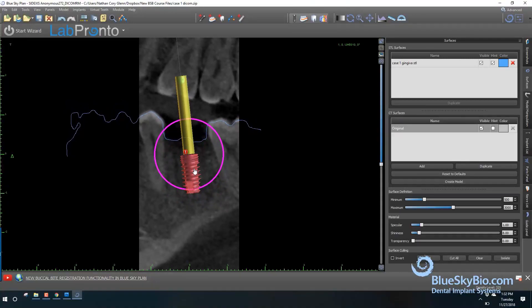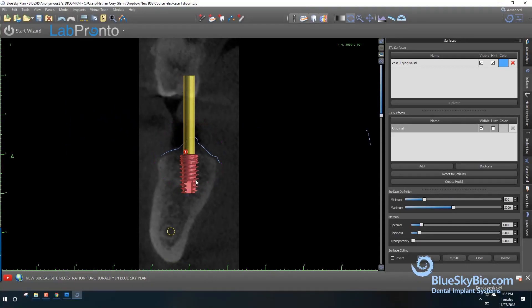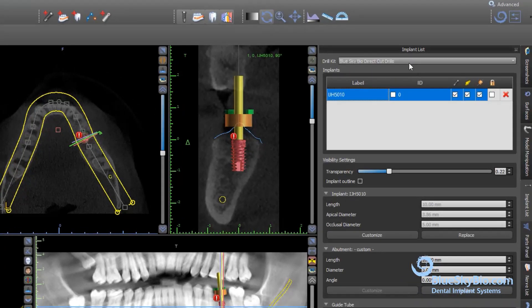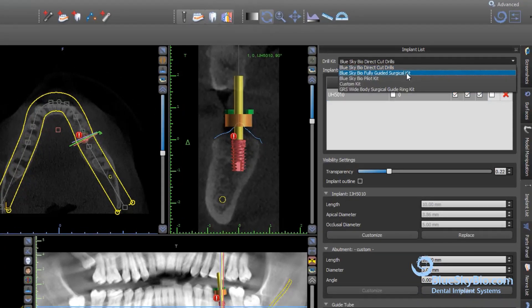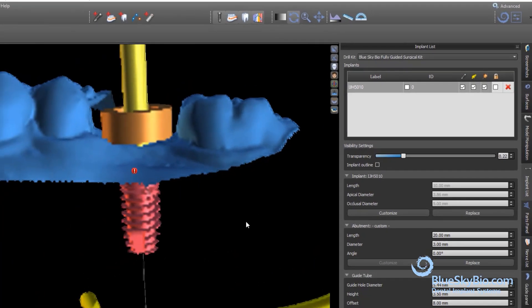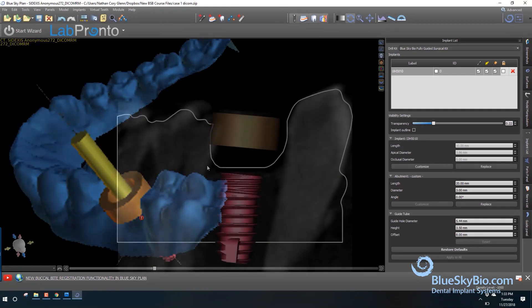Virtually position the implant in the best restorative and surgical position. In the drop-down menu at the top of the implant list, choose the fully guided keyless kit. This will automatically set all the surgical guide tubes to the ideal position.